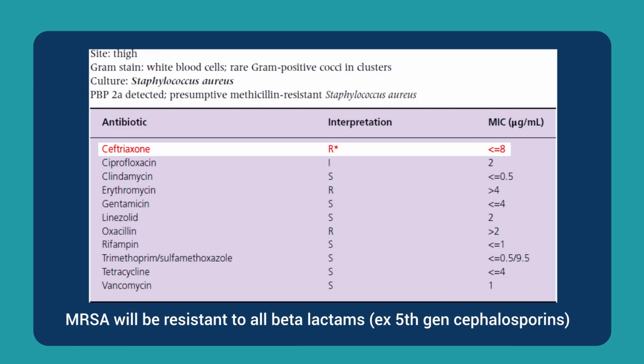less than 8. So what we need to observe here is that every oxacillin resistant Staphylococcus aureus is a MRSA, that is methicillin resistant Staph aureus. MRSAs will be resistant to oxacillin, cloxacillin, cefazolin and all other beta-lactams including carbapenems. So if it is an MRSA, even though MICs may show low for ceftriaxone or carbapenems, you cannot use any of these drugs. You'll have to go for alternatives like MRSA active agents like vancomycin.